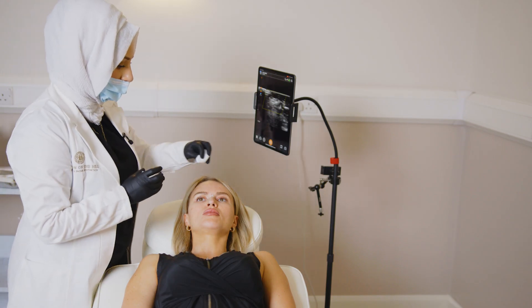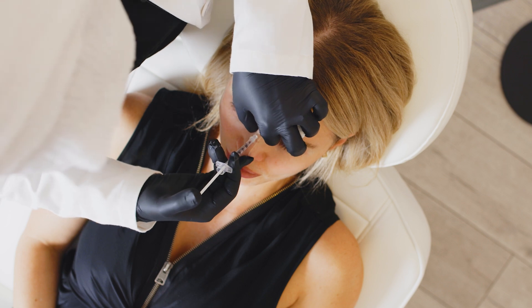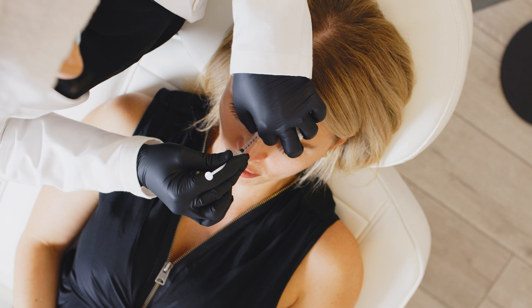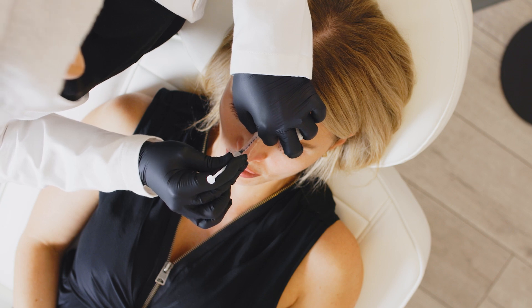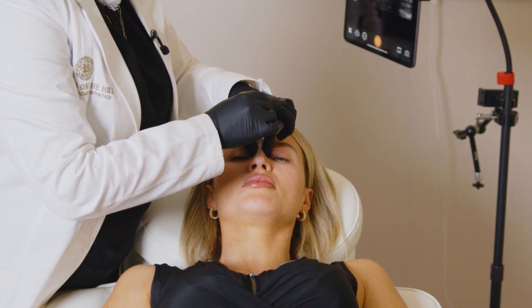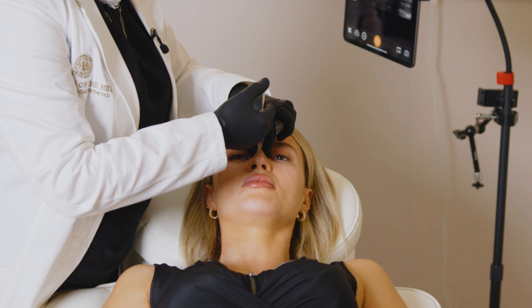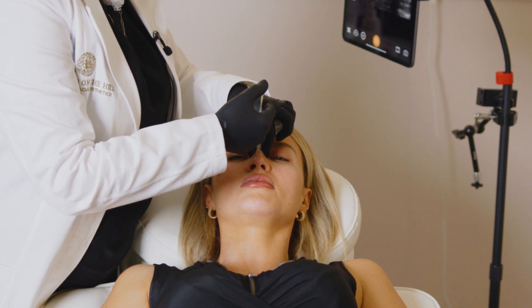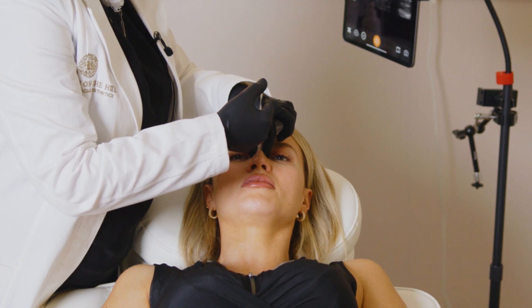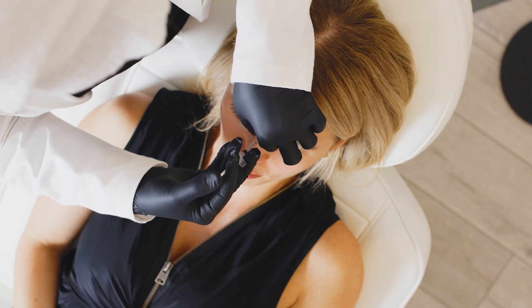Okay, can I go ahead? Aspirating. Finger block either side. Steady stop on the periosteum. Tiny, tiny micro aliquots. Bit of pulsing — so it's 0.01 at a time.